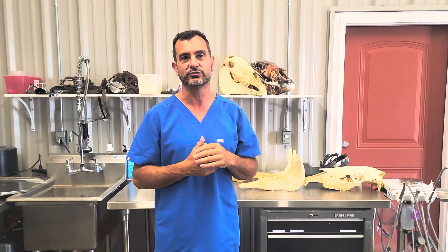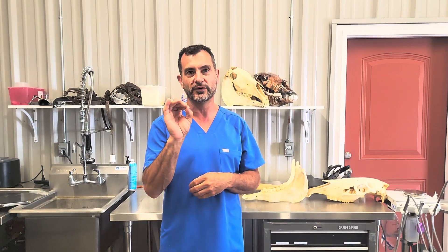In this video we're going to show how to take mandibular x-rays. A lot of people get confused with taking x-rays on the horse's head because there's so much overlap of different structures. If you have a lot of experience it's pretty straightforward, but if you don't or you don't do them all the time it can be a little bit confusing as far as what's the best view and how to do it. In a few minutes we're going to show you a few very clear, concise ways to get pretty much all the views you would ever need to image a mandible.